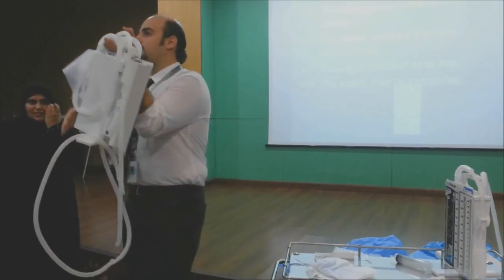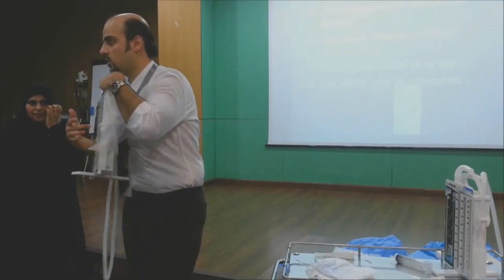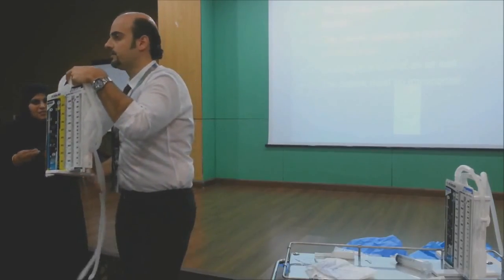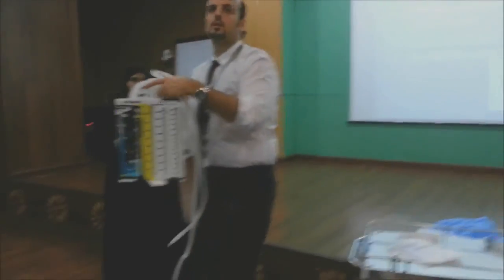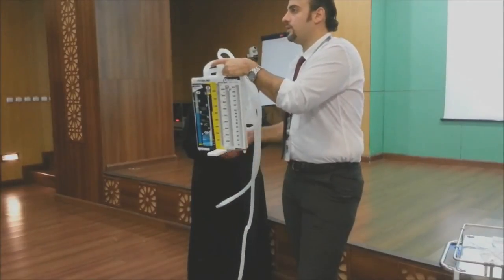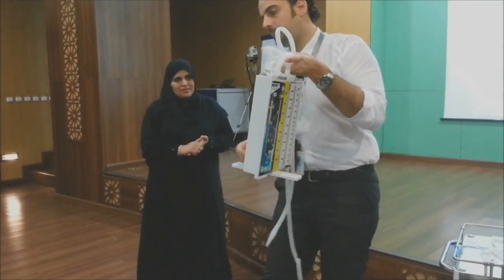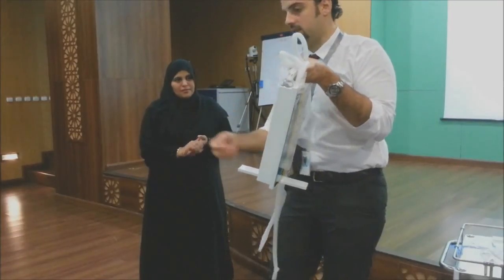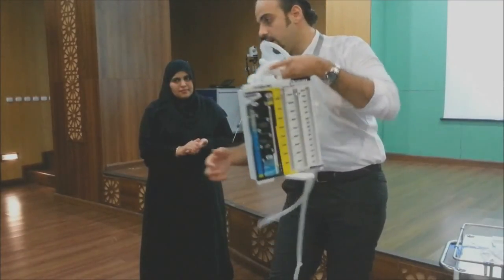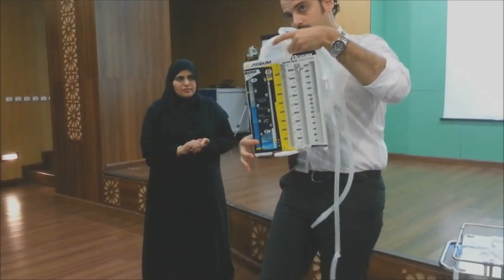If I'm putting water here and it exceeds the yellow marks or the blue marks, what will you do? You will aspirate with the syringe. No. From where? Not through this. Behind there is a small cover. There are two valves here. There you can aspirate, only by syringe. You put your syringe, this one for the underwater seal, and this one for negative pressure.